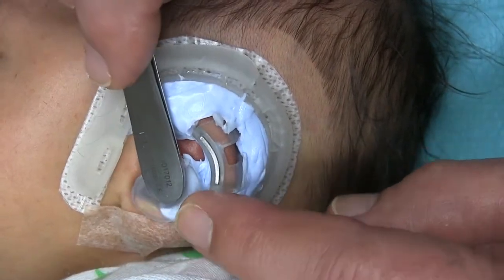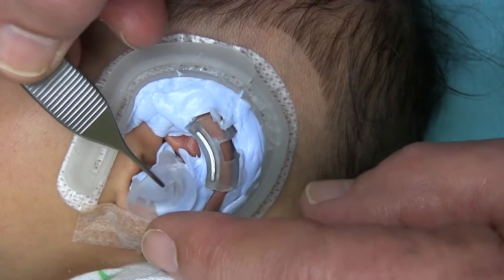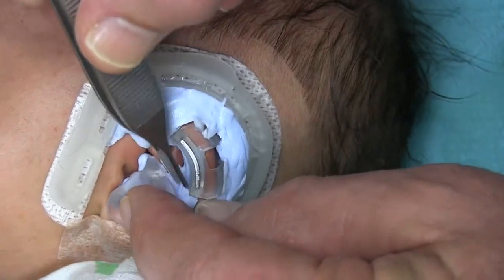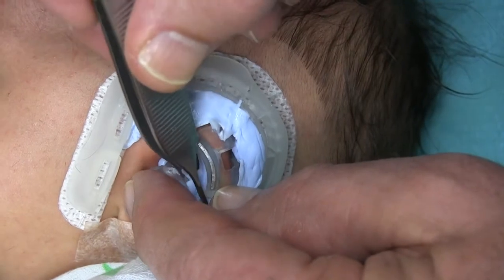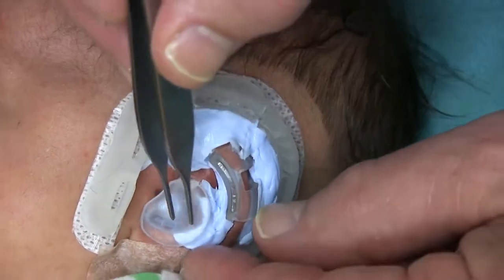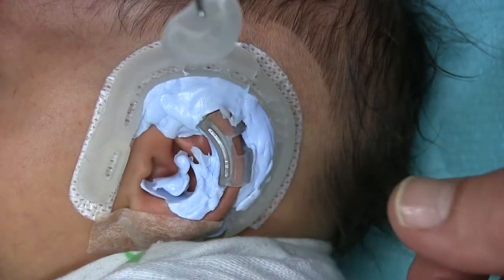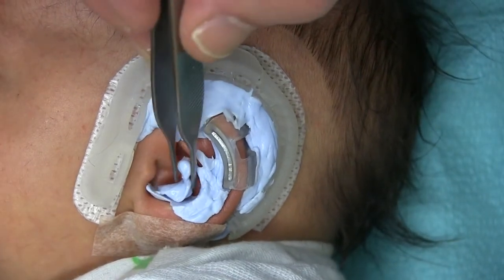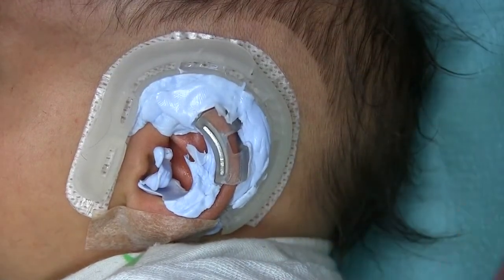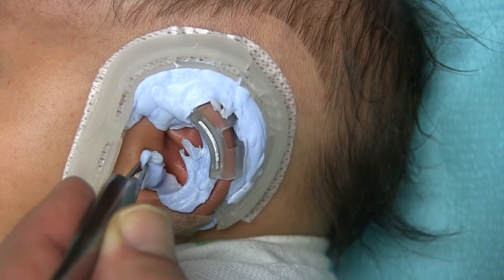You're probably good to look at that now. Can I come out? Yeah. That's the important part. Doing so good. That's the part that pushes that back wall back. Let me see if I can snip that out of there. That part right there is not going to do anything to the scissors. Maybe we got it.